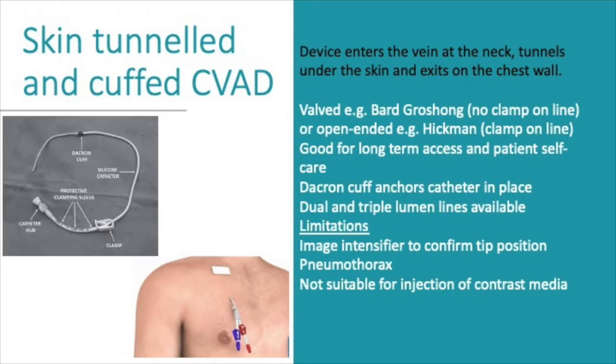Skin tunneled line. So basically this tunneled line is a line that we do not have regularly in this trust. Very, very blue moon situation. So do not remove this line on the wards, all right? You can cause trauma if you take it out. The reason for this is you have a cuff all the way around. So this needs to be booked in for CPOD and removed that way, please.